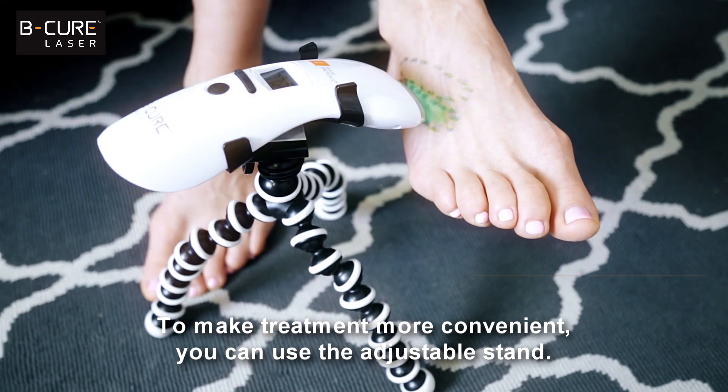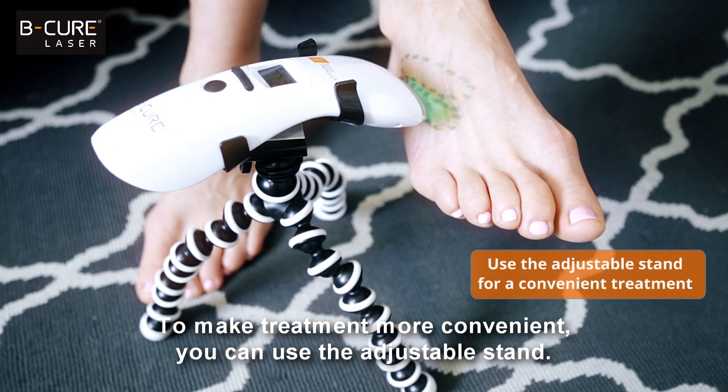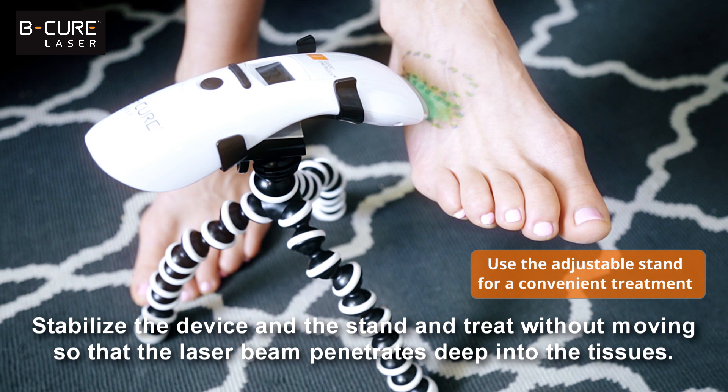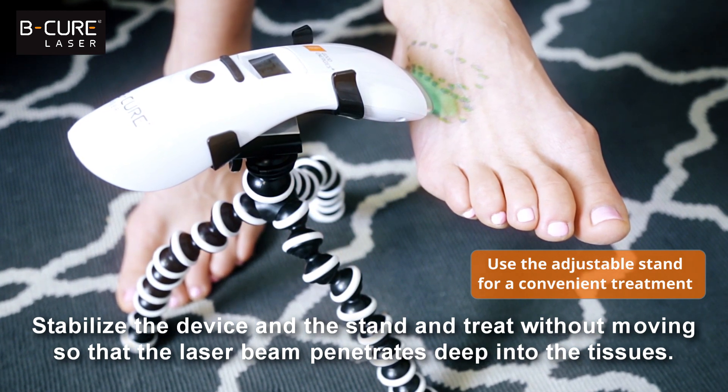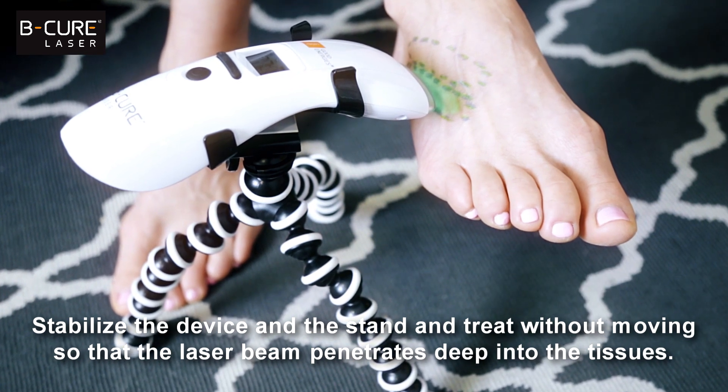To make treatment more convenient, you can use the adjustable stand. Stabilize the device and the stand and treat without moving so that the laser beam penetrates deep into the tissues.